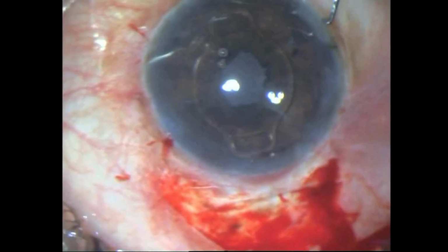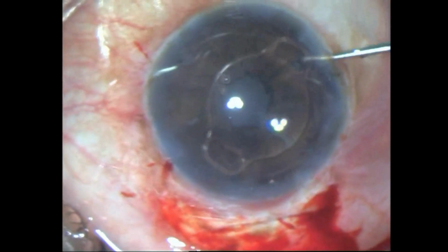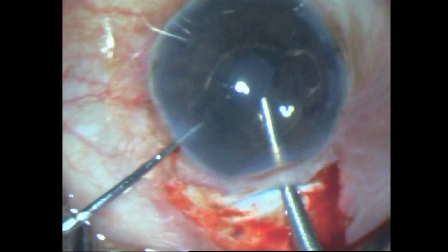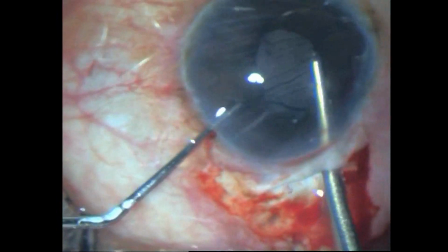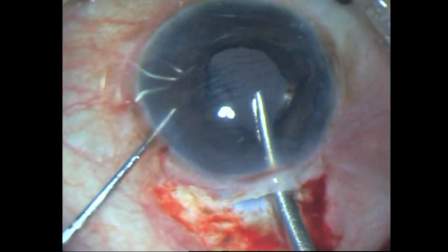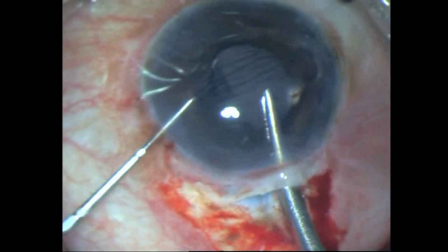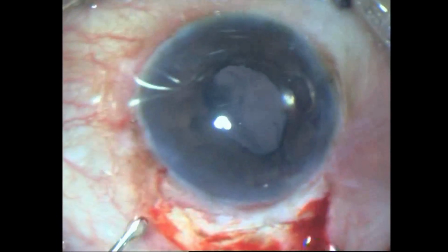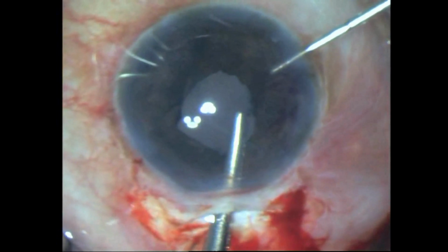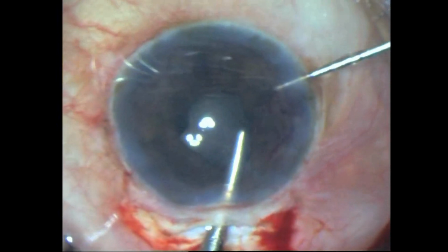Put in my iris clip lens into the chamber, positioned it, and I used a Clayman forceps and a Sinskey hook to enclavate it. Mind you, this is almost my first case of an iris clip retrofixed lens, so I was a bit nervous. However, it went off pretty well thanks to the videos that I watched of Saurav and Kiranjit. I was able to manage this procedure, making sure I enclavate it, and in fact you can see the haptic coming through.